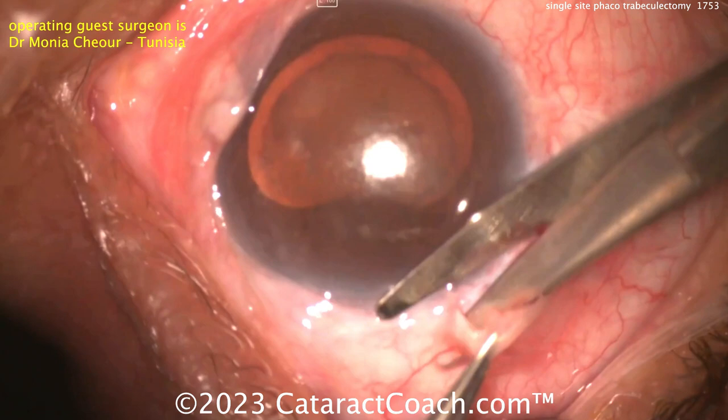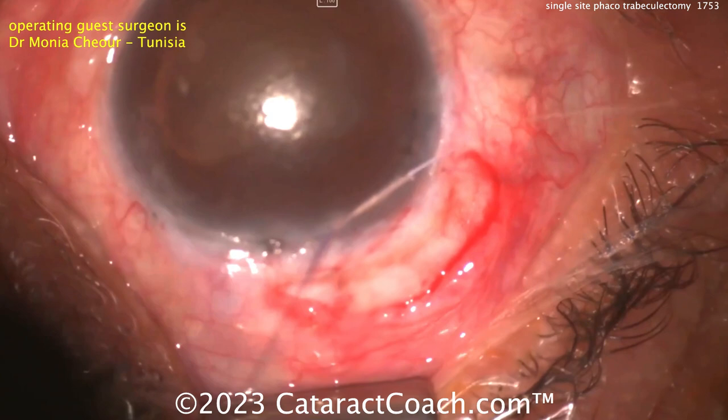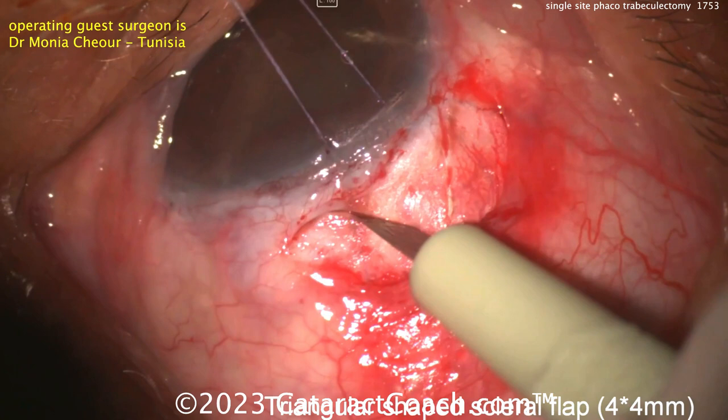Starting off here doing a little bit of a peritomy. You can see a little bit of scarring there on the conjunctiva, making a little bit of a peritomy. The base of this conjunctival opening is going to be at the fornix. Here comes a stay suture — a corneal traction suture being placed there. Cleaning up the sclera a little bit.